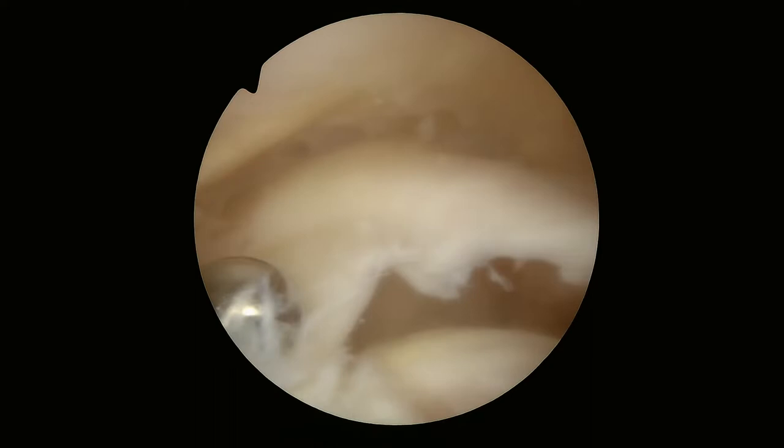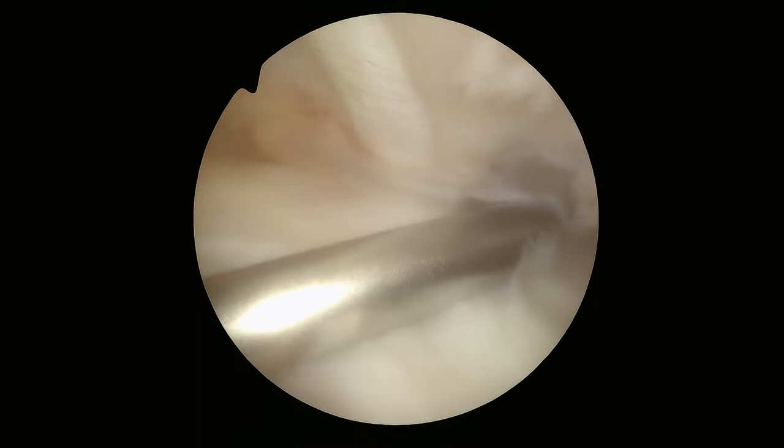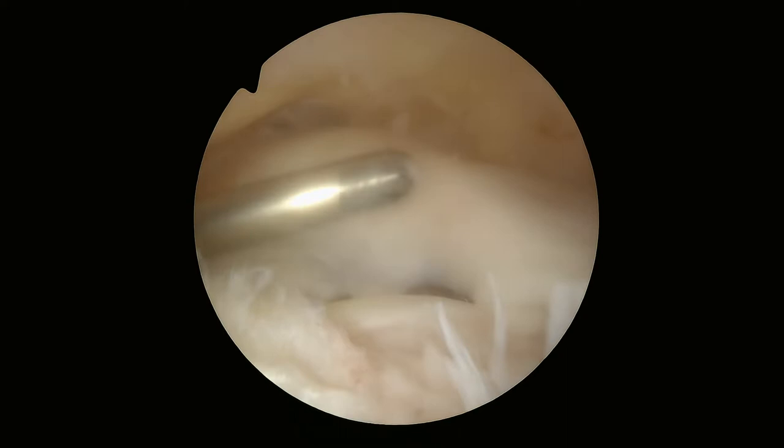This is an arthroscopic picture of the rotator cuff. You can see the cuff and the giant tear. That tear should not be there — it should be hooked to the bone, which we're going to do later on in this surgery.